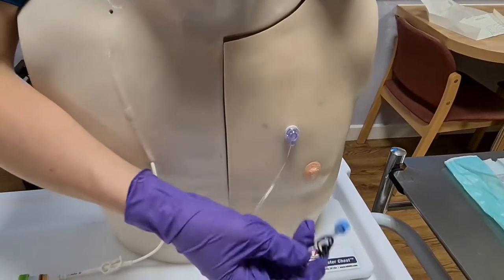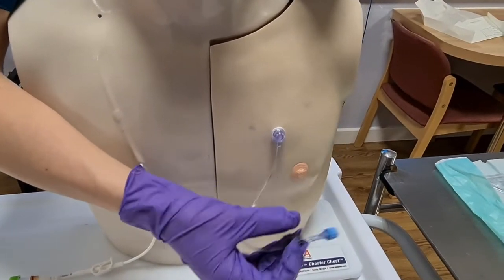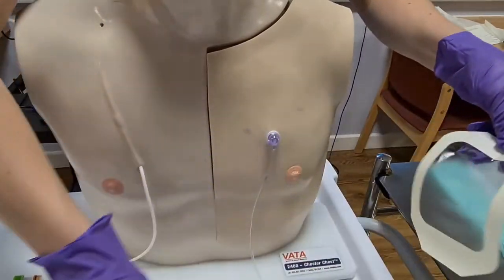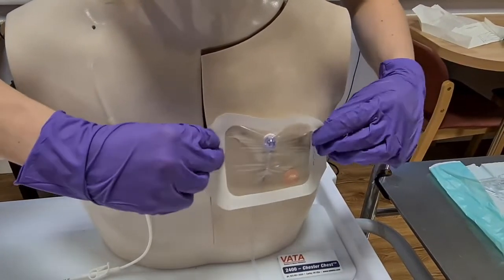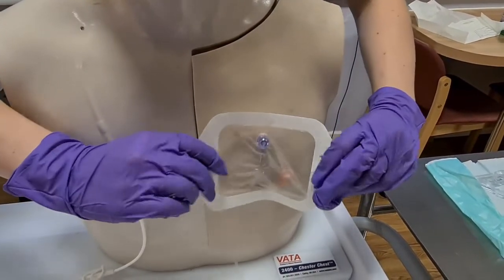So it is a single line, so compatible medication only through. And you place your Tegaderm film over the top. So don't put it on like that, you're going to cause blistering and it'd be uncomfortable for the patient. So get it as close to the line as possible.